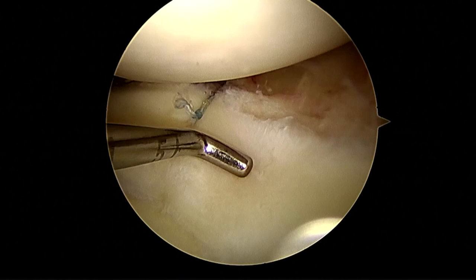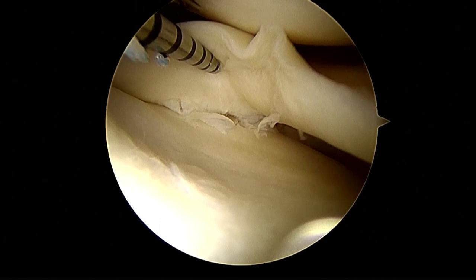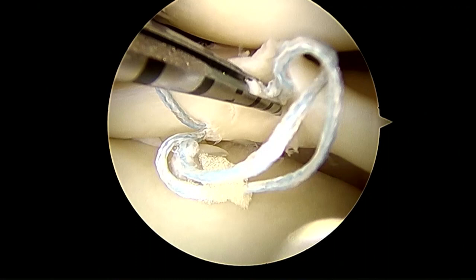Usually this ratio is 2. If we are taking 2 vertical mattress sutures, there has to be a minimum of 1 mattress suture on the inferior portion of the meniscus, so that the ratio is 2 superior sutures to 1 inferior suture. And if we have 3 vertical sutures, 1 here, 1 there and 1 here, we can take in between 1 horizontal mattress suture on the inferior portion of the meniscus, so that it gets compressed there. Good compression of the inferior part, and this elevated part of the meniscus will settle down.